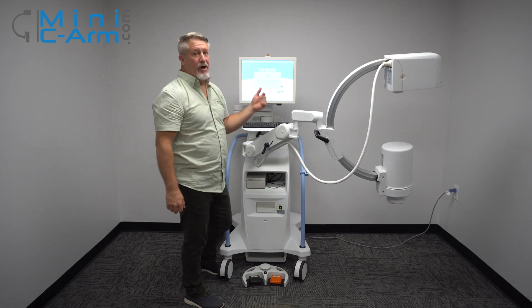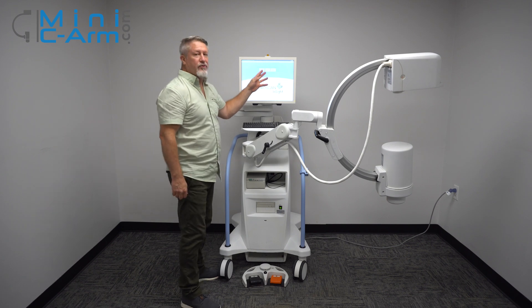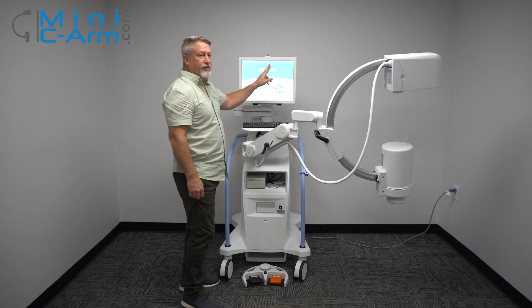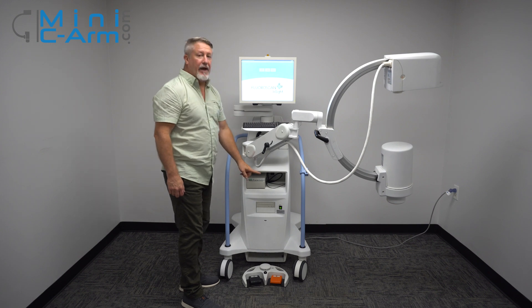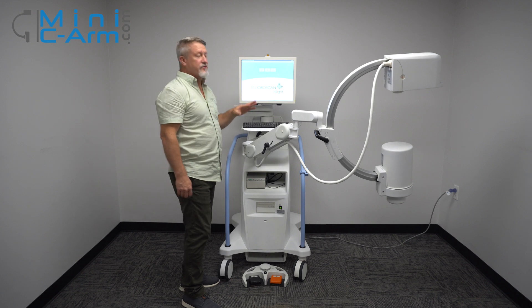Once we boot up, we're going to show you how to go into Perform and Review. Note that when you're shutting the machine down, always use the shutdown on the screen, not the power button. That allows Windows to shut down properly and gives you fewer issues in the future.